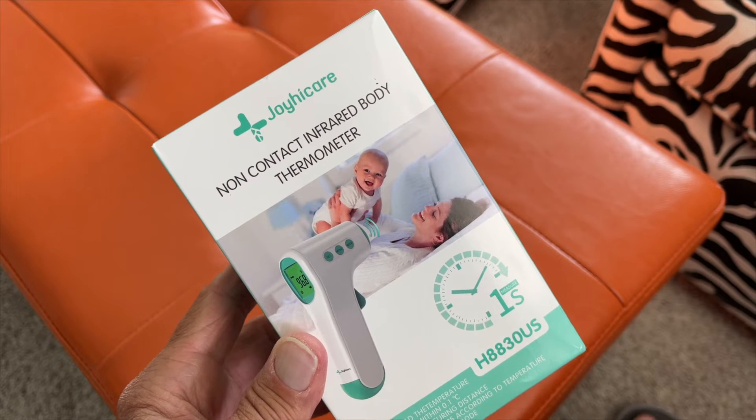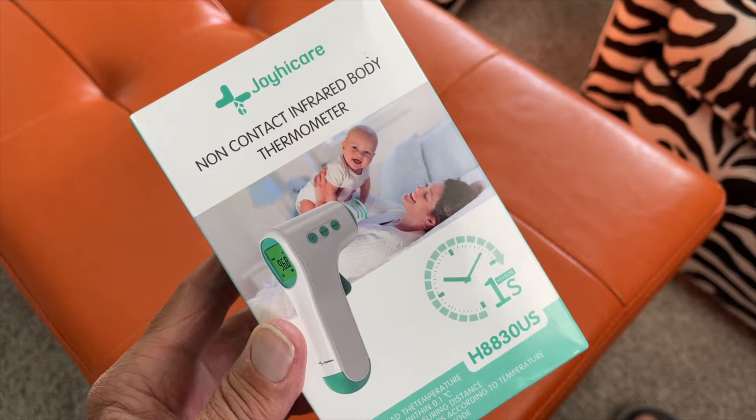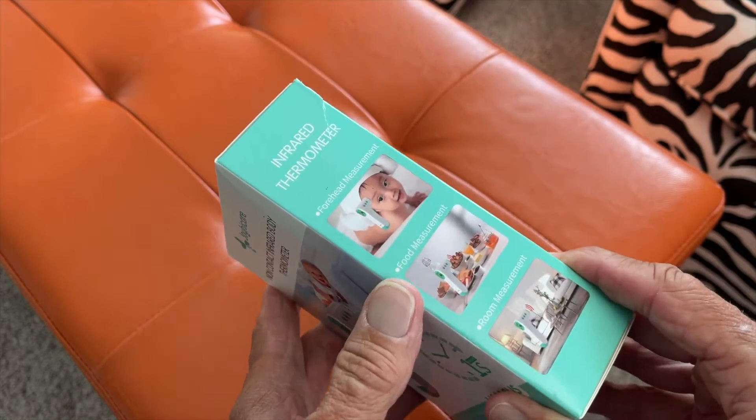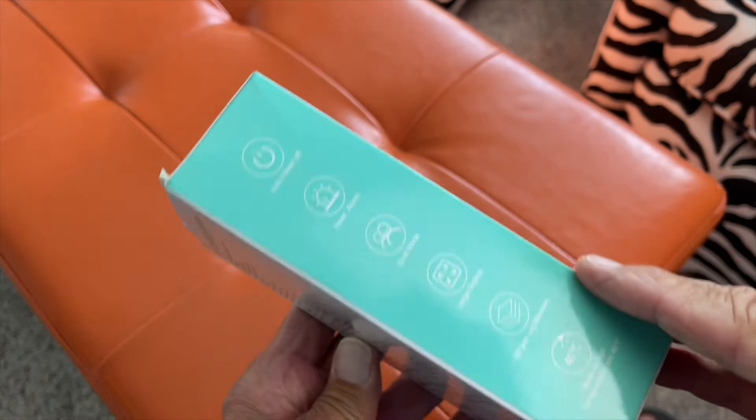I just received the Joyhicare Non-Contact Infrared Body Thermometer, and this is a little bit different than the other one that they sent me. We'll go ahead and go through this and unbox it.